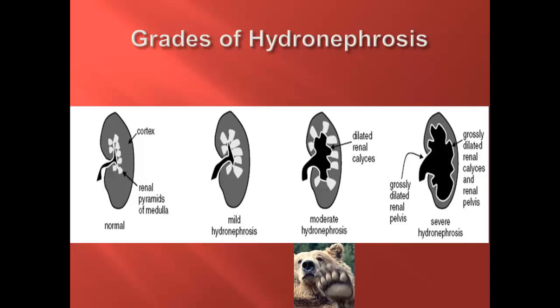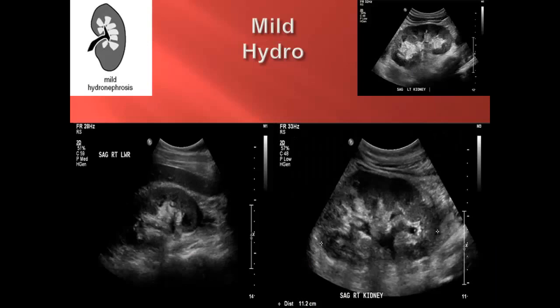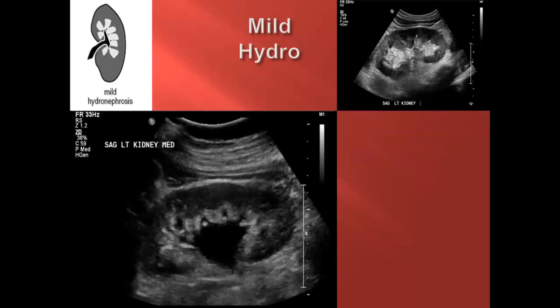Now let's look at a few examples of the different grades of hydronephrosis on ultrasound. Here we have two examples of mild hydronephrosis in the bottom half of the page and a normal kidney for comparison in the upper right corner. Notice the mild central dilation of the predominantly hyperechoic sinus. Comparing the sonographic appearance of mild hydro to that of a normal kidney, one can appreciate that the renal architecture is undisturbed for the most part. Here we have a more prominent example of mild hydronephrosis, and you can appreciate the significant central dilation of the hyperechoic renal sinus.